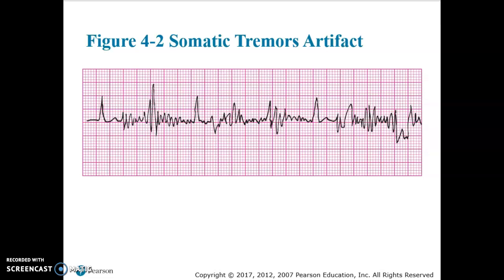If the patient is running a fever and they're shivering, we may give them Tylenol. So we've got to treat the cause when we're dealing with somatic tremors. But you can pick out the QRS here. So you can look at this and see, okay, we have a QRS, P, well, we're tremoring here, but I'm going back into a QRS here. So you can see those march out.